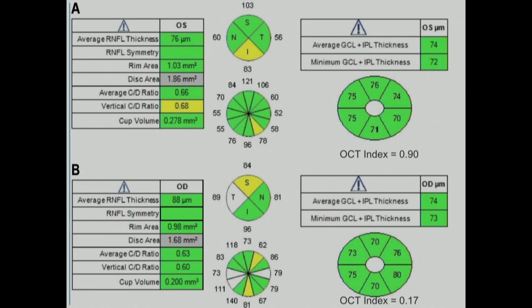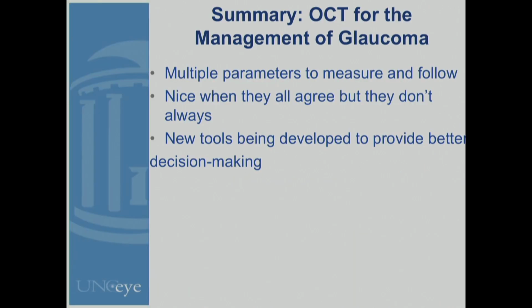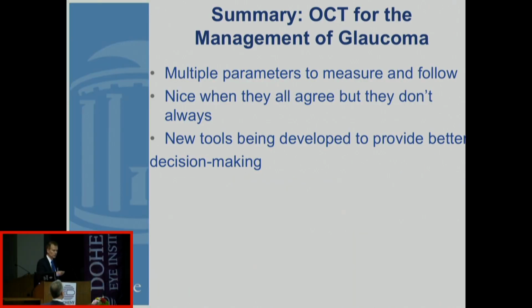And we found, just like with the GDX NFI, nerve fiber index, there is a cutoff at about 0.34 that could lead the clinician to conclude that this is a structural indicator of early glaucoma, and anything below 0.34 is not. Certainly, the higher the probability towards 1.0, the more certain you are. So anyway, we have all these parameters, dozens of them now, but we can put them into a formula to come up with a single index.